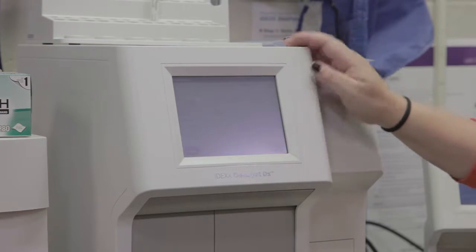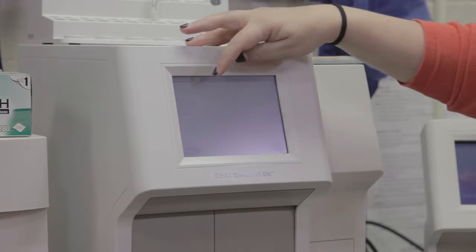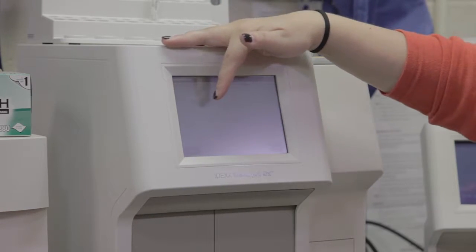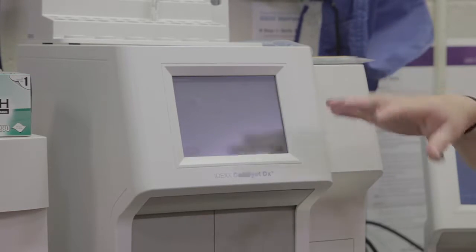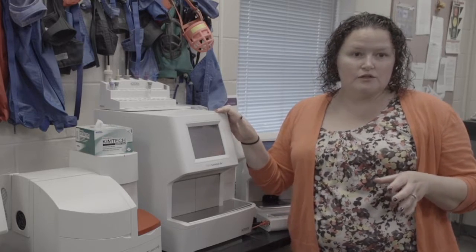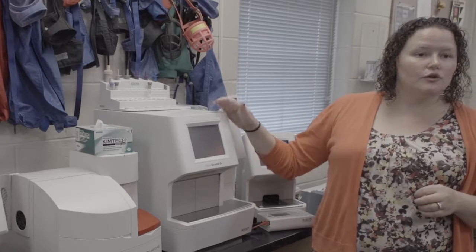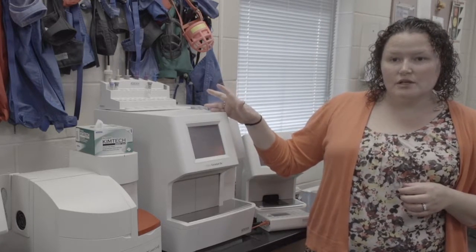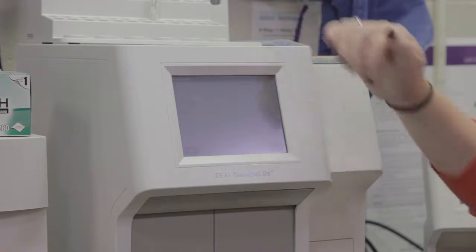So now it wants to know what type of sample am I running. And it may be a little hard to see from back there, but your options are whole blood, plasma, serum, urine, and other. If you're going to use our lithium heparin whole blood separators, you have to choose whole blood. It's the only way the analyzer knows to spin the sample for you. If you're using plasma or serum, just choose appropriately, plasma or serum.